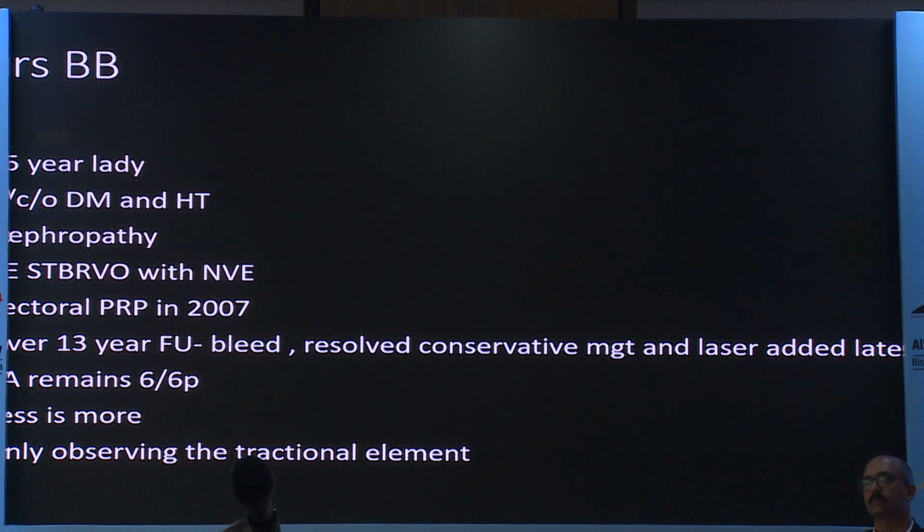So just going back into the real world, this is a patient where we found this modality useful. It's a right eye STBRVO NVE. PRP done all the way back in 2007. Over 13-year follow-up, there were bleeds, but vision remains fine, and only observation was recommended.